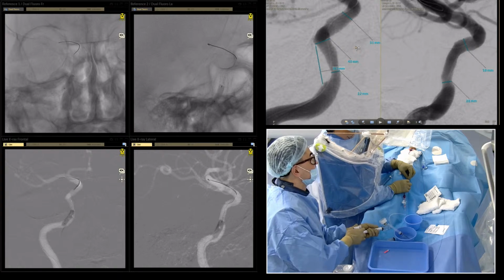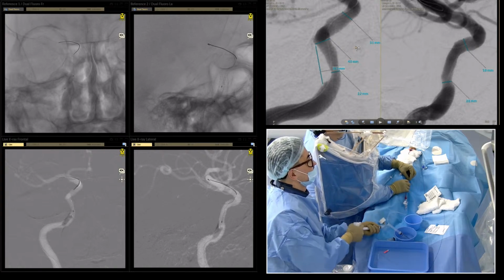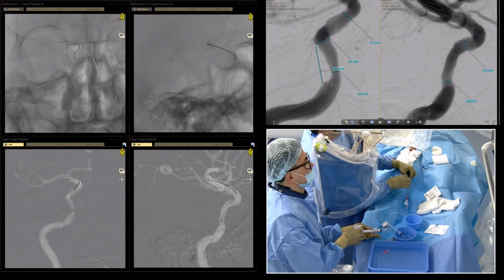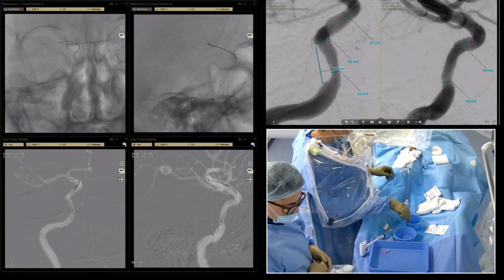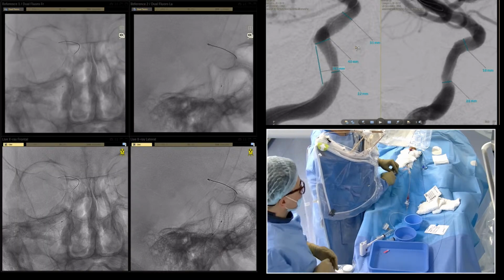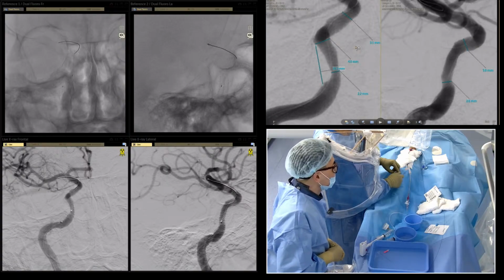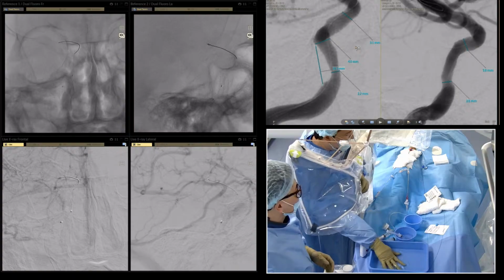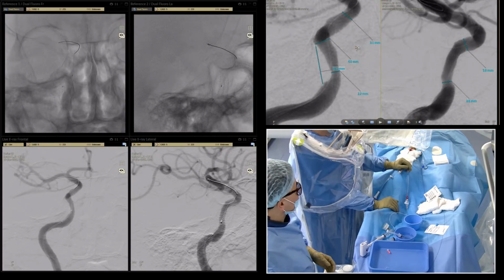Yes, we gave nominal pressure for the proximal part. The distal was 3.26 and proximal is 3.5 millimeter. Now I think it's good. I think it's enough.